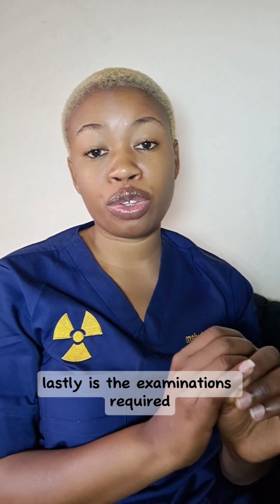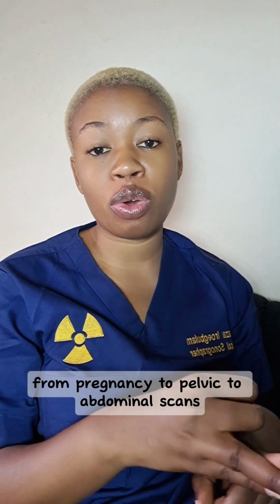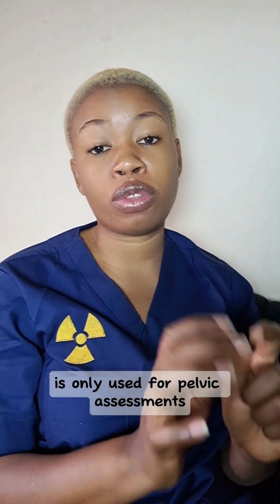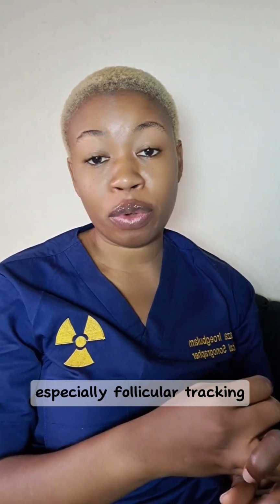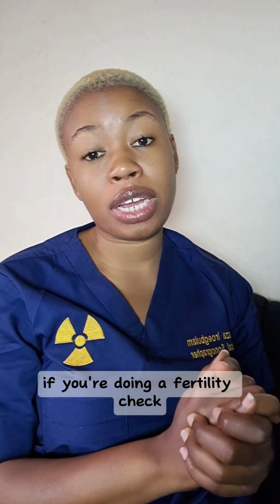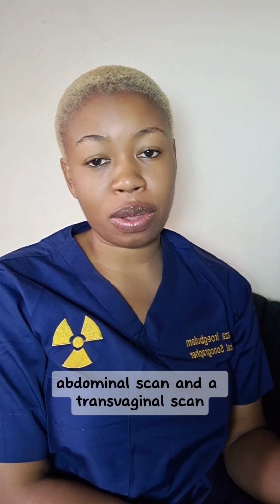Lastly is the examinations required. A transabdominal scan can be used for a wide range of examinations, from pregnancy to pelvic to abdominal scans, but a transvaginal scan is only used for pelvic assessments, for early pregnancy, and for fertility checks, especially follicular tracking. Usually a transabdominal scan is not the scan of choice if you're doing a fertility check like follicular tracking. That's the major difference between a transabdominal scan and a transvaginal scan.